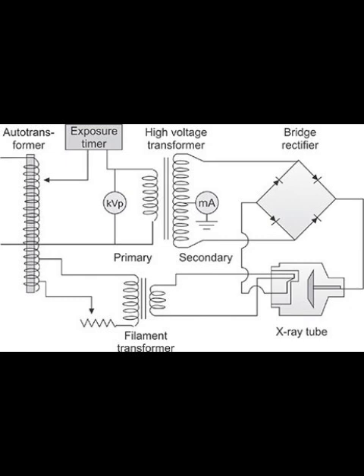Well, it really comes down to control and, frankly, preventing disaster. The X-ray tube itself needs this perfectly one-way direct flow of electrons from the cathode to the anode. A one-way street. Exactly. Imagine trying to push water through a pipe, but the pressure keeps reversing, super fast. Chaos. Right? So if AC, that back and forth current, 60 times a second here in the US, 60 hertz, were fed directly into the tube, it would be damaged very quickly, maybe even destroyed, because the electrons would be slamming into the wrong parts at the wrong time, literally burning things out. It just can't handle it.